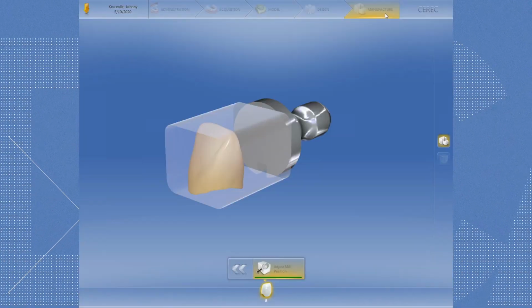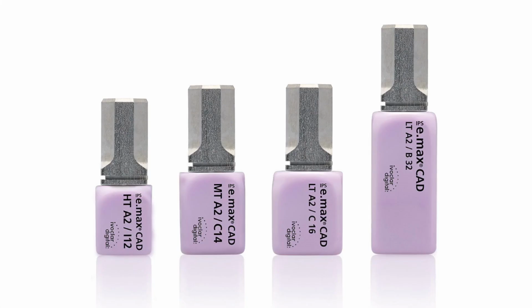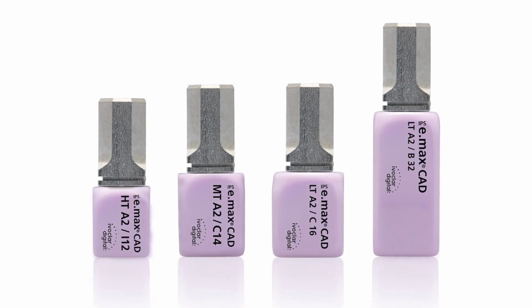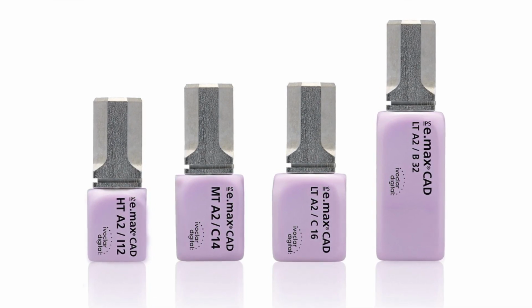out the restoration. And what I've done here is I currently have 3 crowns I've milled out. I'm working on A shades right now, so I have an A1, an A2, and an A3 that I've milled out from the respective blocks. If you haven't used CAD-CAM, each block is matched to a shade. So you may have an A1 shade block, you have an A2 shade block. So if I'm trying to mill out an A1, I grab the A1 block, and then that's what we mill the crown out of. So it's pretty cool process.